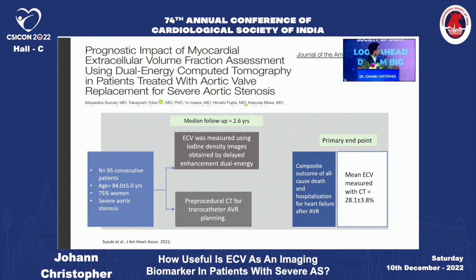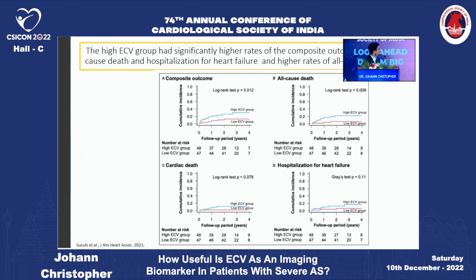It's the major tool. So people have now looked at measuring ECV on CT before they went in for a TAVR, to see how the ECV looks. Now, how we did that was we used a dual source or a single source dual energy scanner. They are completely different from the run-of-the-mill 64 or 128 scanners that most of us use. These have dual energy and therefore they can also measure the myocardial volume and ECV.